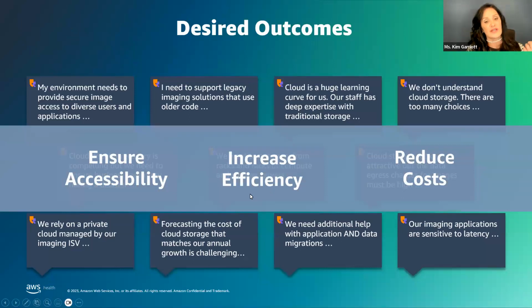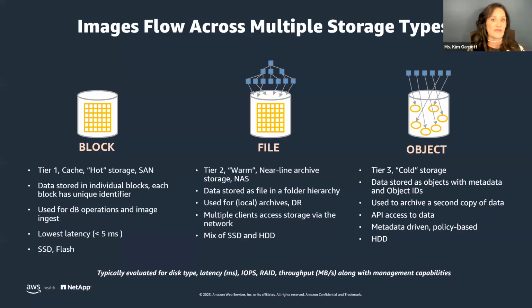So ensuring accessibility, increasing efficiency, and reducing costs are these really high level themes that we're hearing from customers and software vendors as to why this movement to the cloud is happening now. And so Sasha is now going to take us through some more basic technical components of medical imaging, and then we'll tie it all together into this cloud journey.